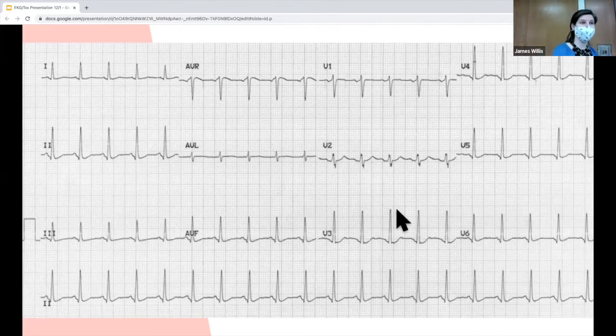So this is interesting. This is quetiapine toxicity. Quetiapine causes a brisk sinus tachycardia as well as a prolonged QT interval. But quetiapine has a relatively low risk of torsade as compared to other QT prolonging medications. And similar patterns can also be seen with other atypical antipsychotics.